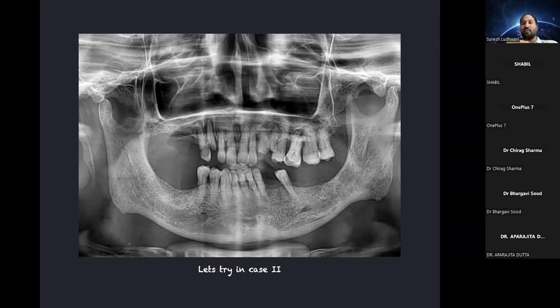From there, you are supposed to prepare two bisectors. One is a horizontal line which will be along the alveolar bone going till the back, and from there a vertical line along the fissure. That triangle is your safe bone.